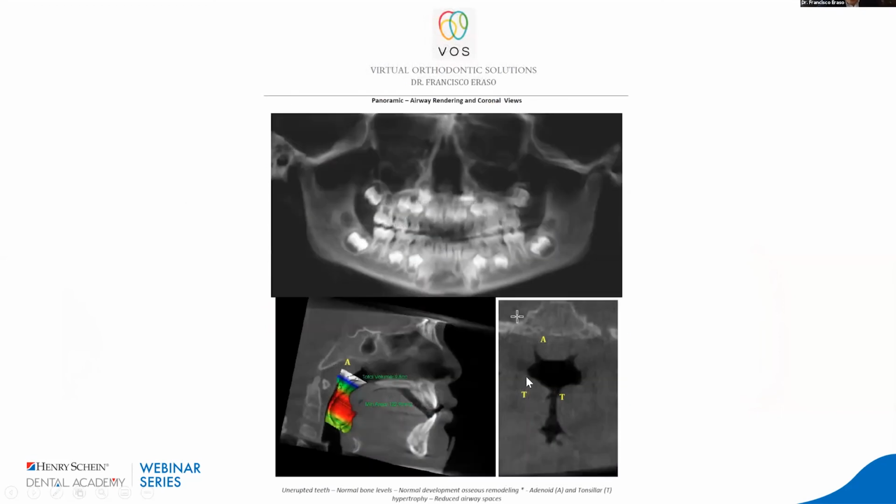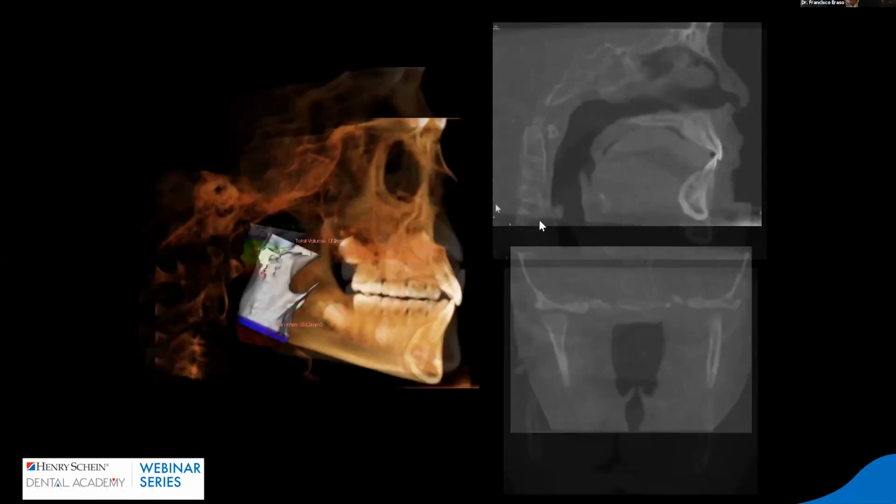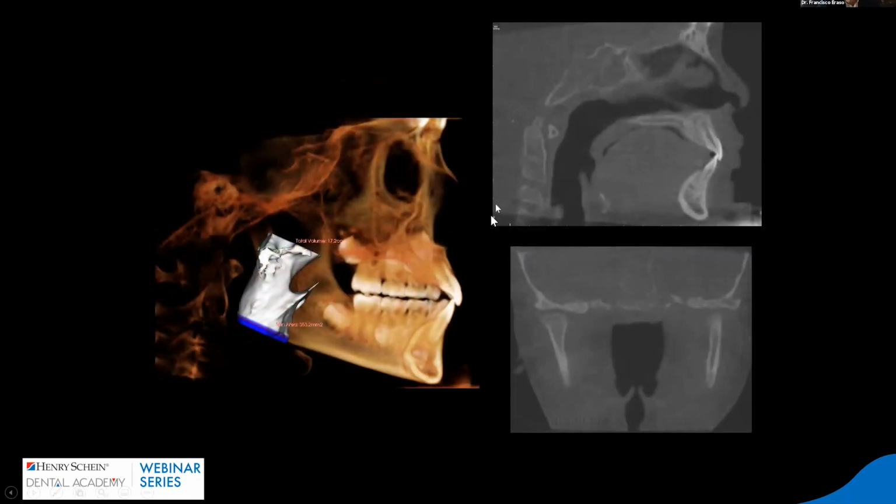a patient that I have, a brother that has not only adenoid but tonsillar hypertrophy, very early mixed dentition, class 2 relationship, okay? And again, you're going to segment and you're going to diagnose, you're going to go over the whole study, and you're going to go before and after, look at the beauty of the interaction with the ENT.